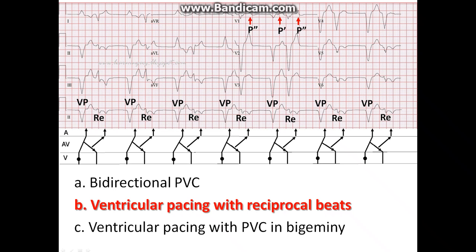The reciprocal beat is followed by another retrogradely conducted P wave with an RP interval of 360 milliseconds. At 840 milliseconds from the reciprocal beat, or at about 70 beats per minute, a pacer spike can be seen. So the answer here is B: ventricular pacing with reciprocal beats.